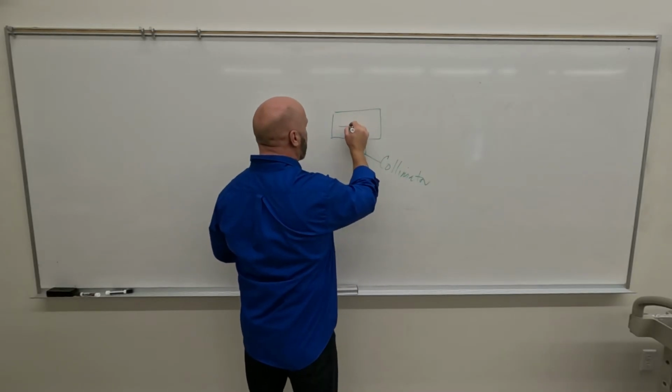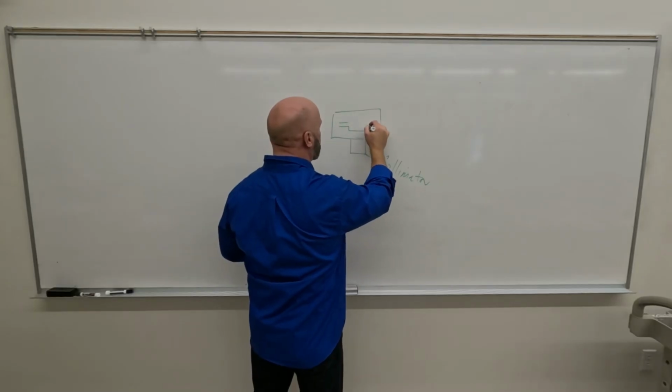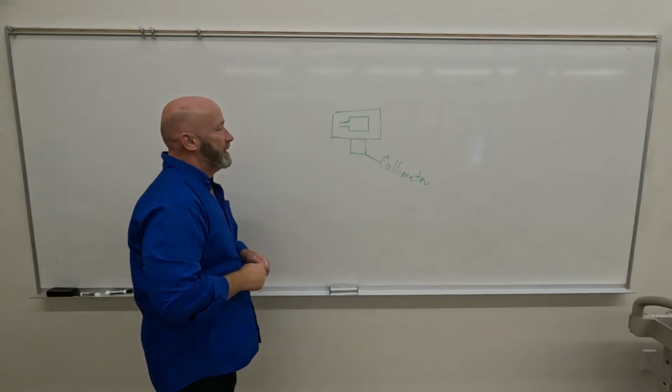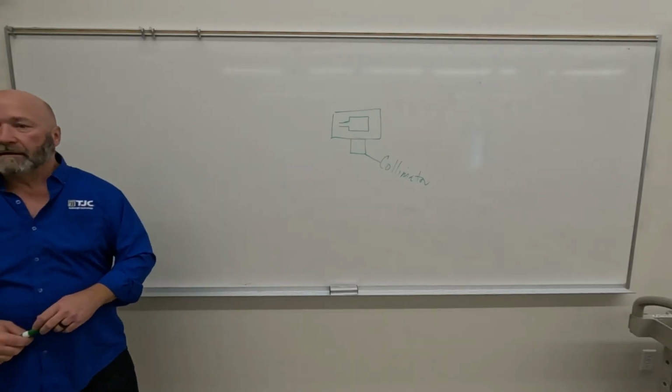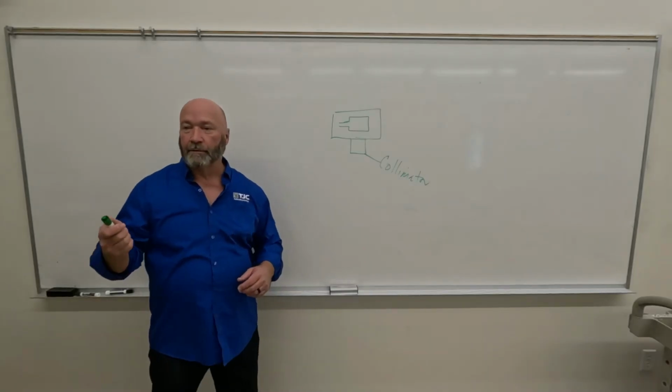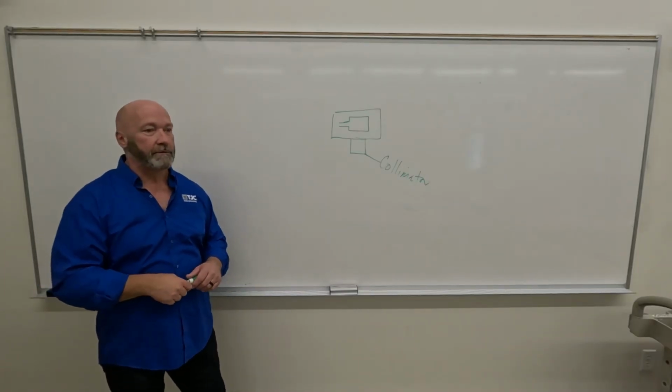And it is where the X-ray tube is housed. Okay, so you got the X-ray tube inside the protective housing. The protective housing does a lot of stuff. It protects the X-ray tube against you, and it also protects you against the X-ray tube.